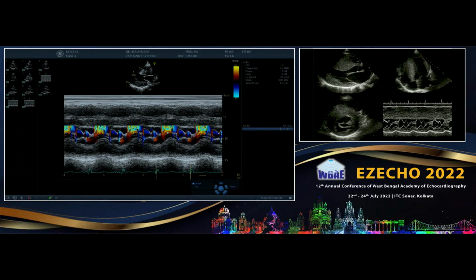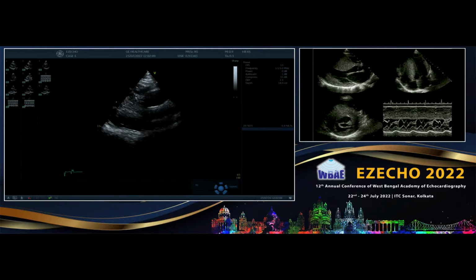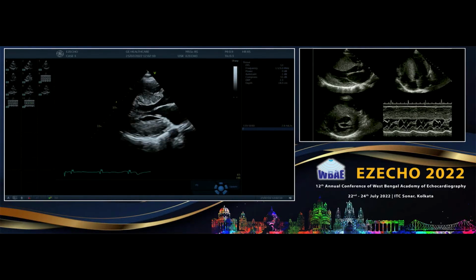Now the first thing, as we know, the first two factors clinically are whether his first degree relative has a sudden cardiac death, or he has an unexplained syncope, or he has a resuscitated cardiac arrest. These are the most important things, which are history, which is not echo. Now we will go for the maximum thickness of any focal maximal thickness.